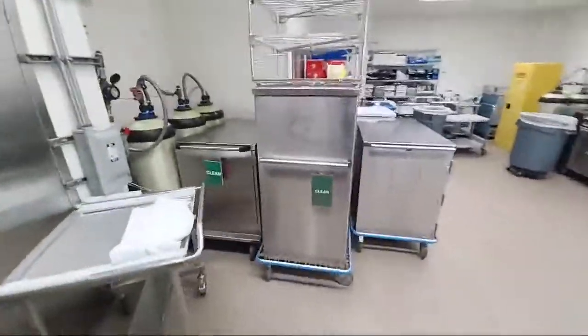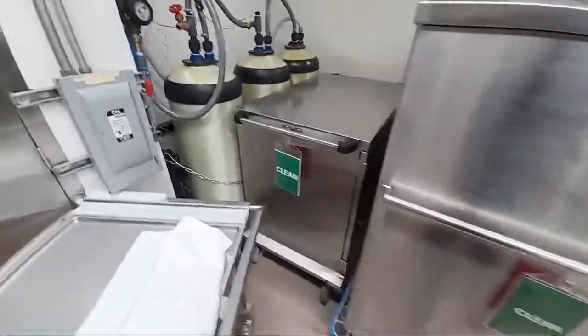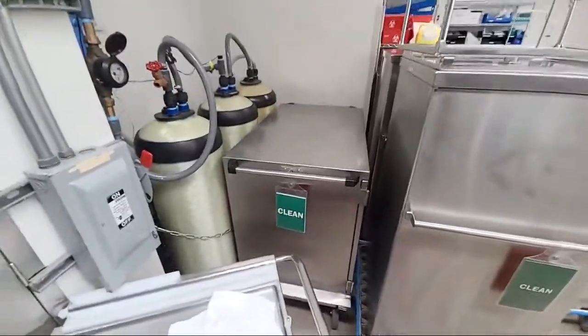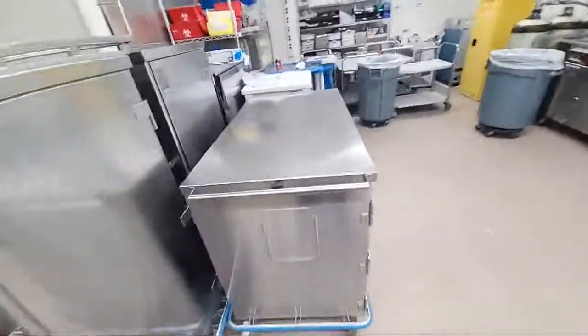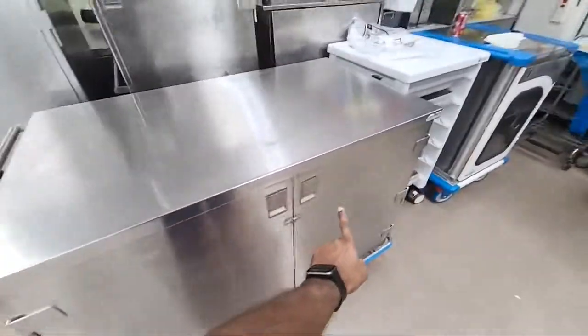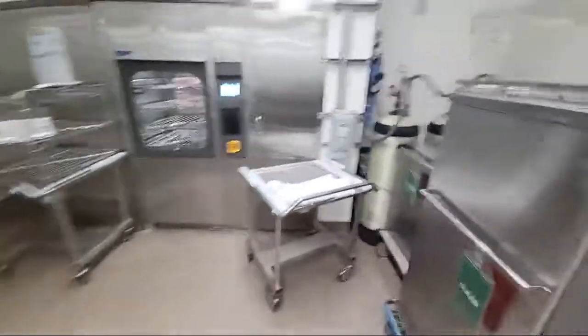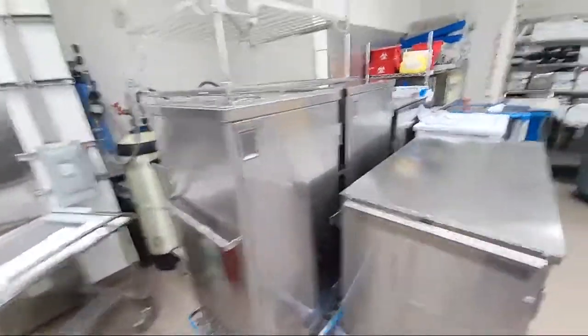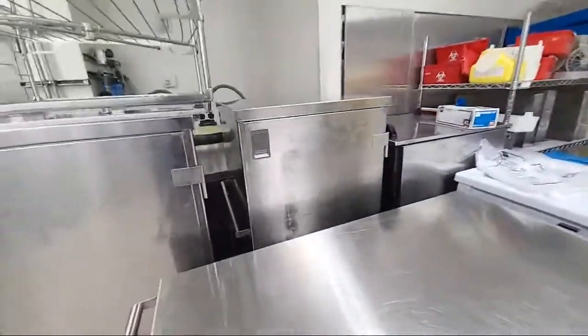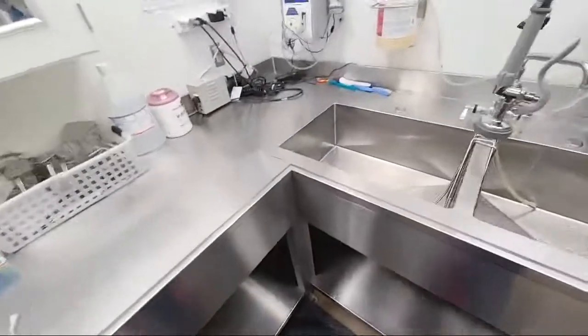Coming in, these are the carts that we bring from the OR. The bigger ones we take down to CVOR, cardiovascular operating rooms, because they have the robotics usually. They're using those, so it fits long ways in there. These are the normal ones we just keep up here in the OR. And there's another one. So we need to have multiple ones, obviously, so that they can be replaced. We exchange them so they always have one.